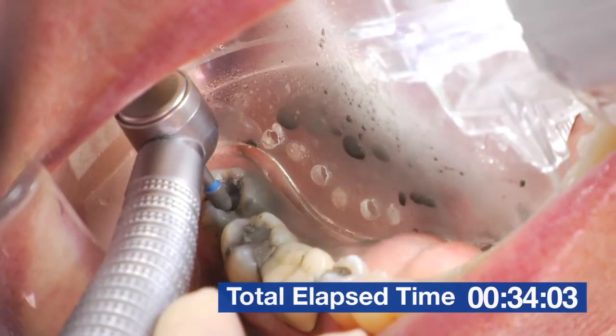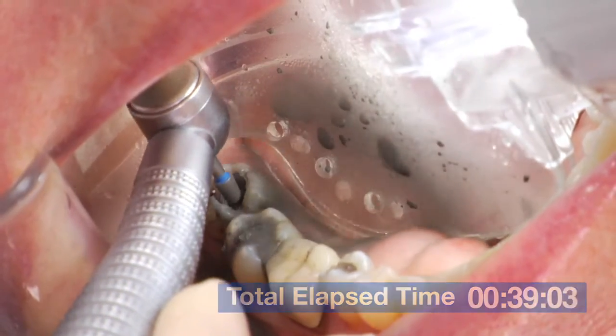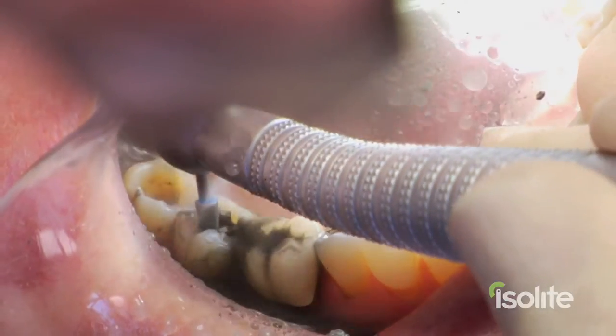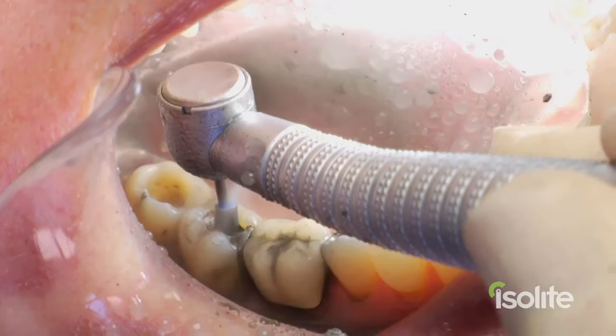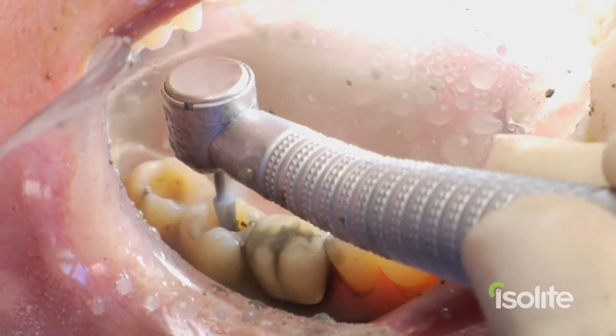You can see how all the water is evacuated and all the silver is just picked up. Notice that my assistant is not retracting or aspirating. She's always staying one step ahead of me, making the procedures go faster, smoother, and more efficient.